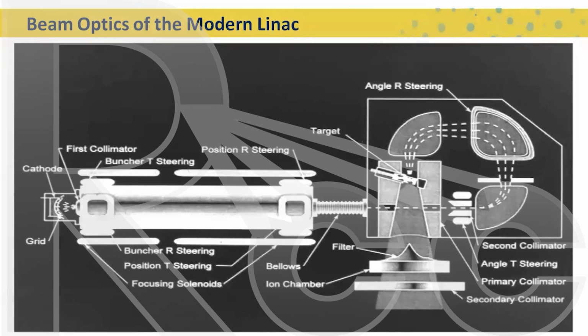And then there were all the other linacs before the TrueBeam. There was the Trilogy system. There was the Clinac series before that. So Varian went through this whole evolution of machines, and it stops at TrueBeam, and then they're moving on to a CT gantry style, like a tomotherapy machine. Varian is now making its most modern accelerator that looks like a tomotherapy machine, and it comes with CT imaging included, plus tomotherapy beam delivery, and you're going to see MRI included in these new machines. So they're going to go from CT image guidance to MR guidance, which gives the therapist even more information to target the tumor by.